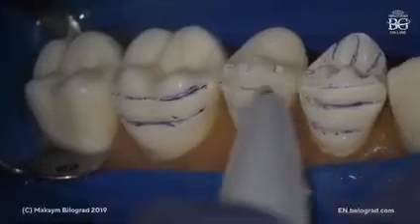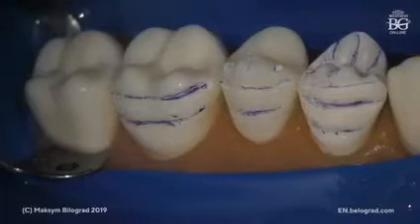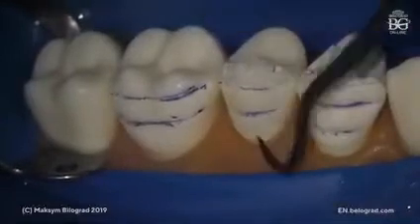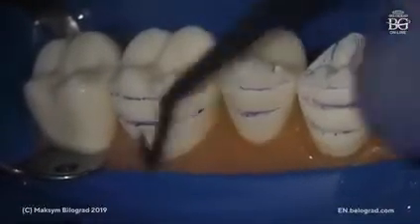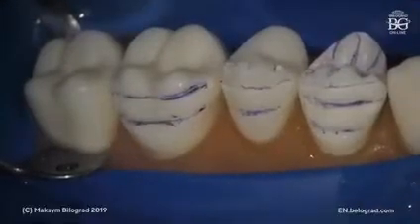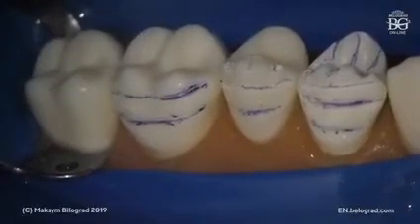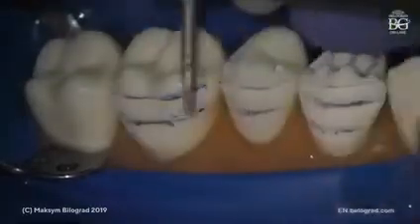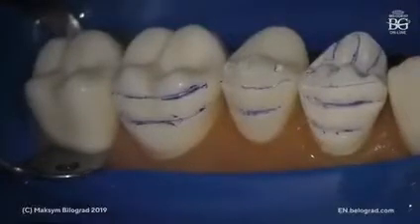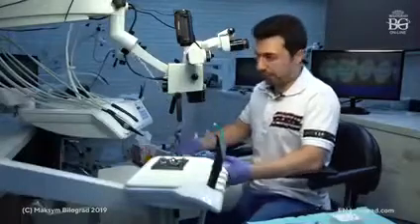Okay, so what I'm trying to say is that after you mark everything as you see here, I would remove mock-up. I will take some instrument like this one. This is hand scaler, and I will just take out all this mock-up, and I will be able to see where I reach tooth surface. Okay, and after that I will just take my another burr, medium grit or coarse, and I will start to join these grooves. This is the sequence. Considering the fact that we are working without mock-up, I will just continue preparing these teeth.